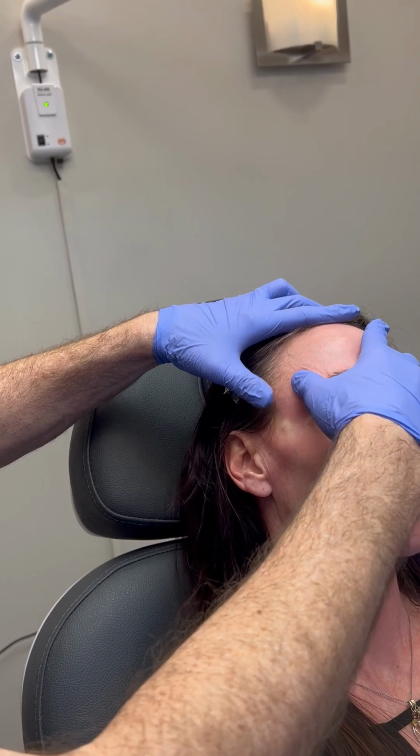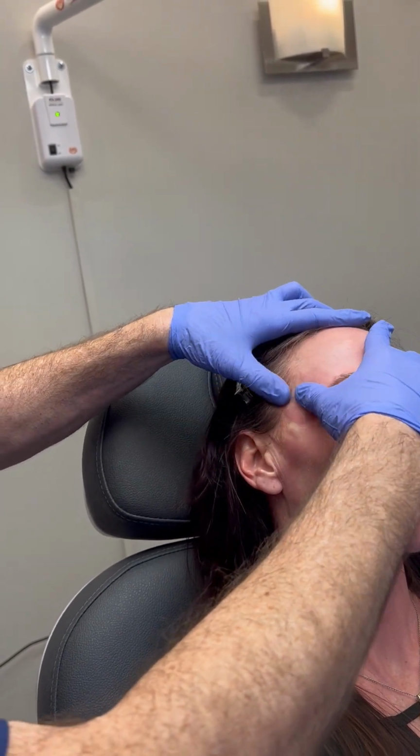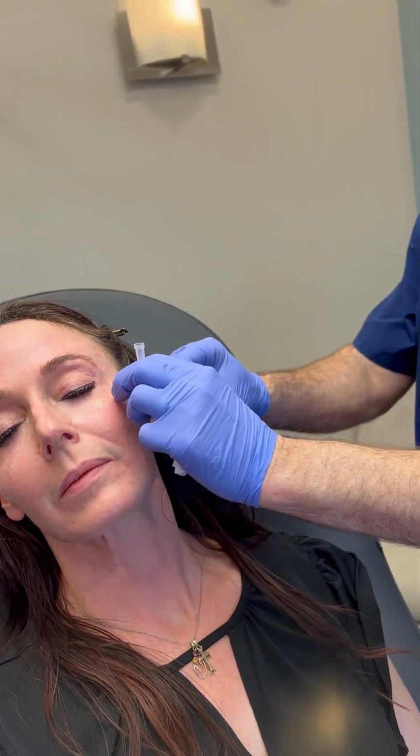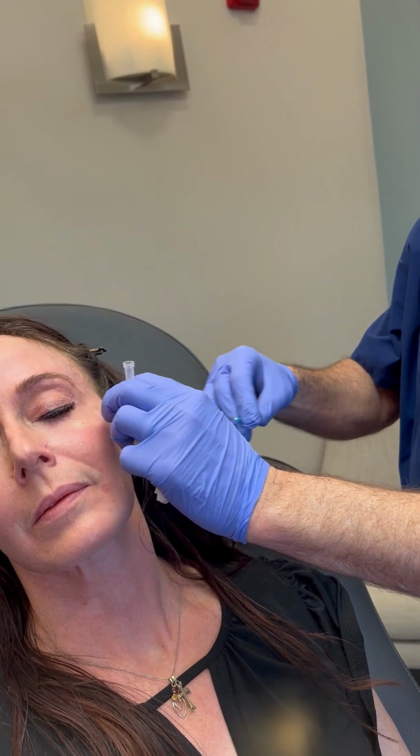And we've pre-numbed our entry areas, that's why we see that little bump there. So we'll do the same thing on the other side. We'll create just a little port there.